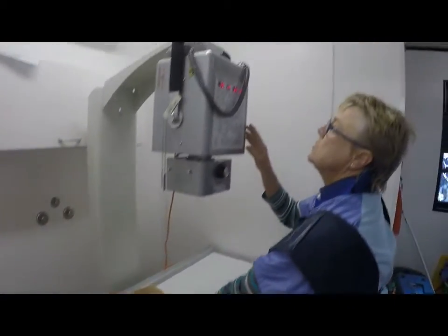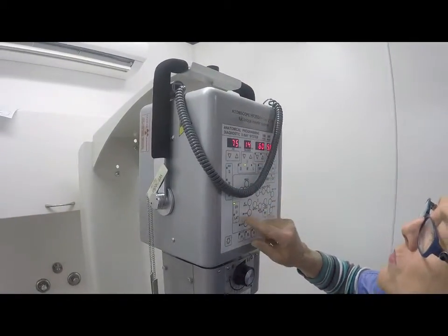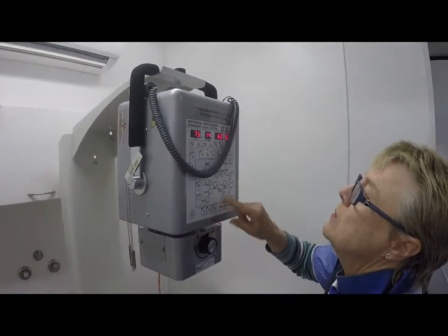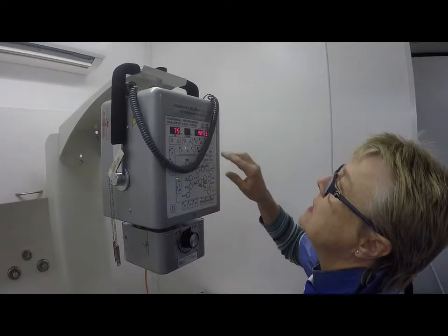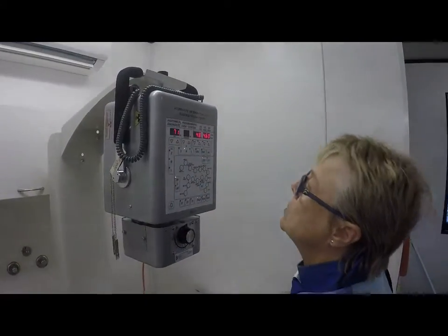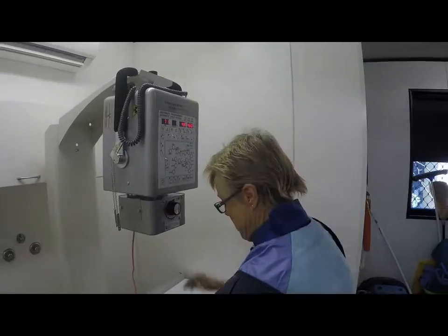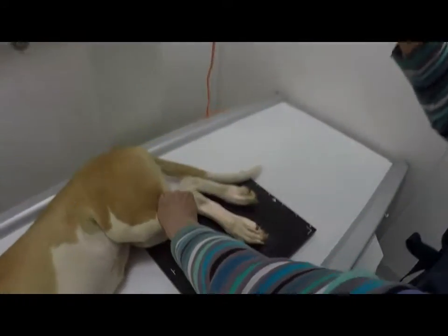So the x-ray machine is on. Now I have to select the size of the dog and what sort of view we are taking of the dog and which area we are taking — which is the tarsus — and there are just a few other adjustments to the x-ray. Turn on the light, get the area focused, always making sure there's safety for everything.